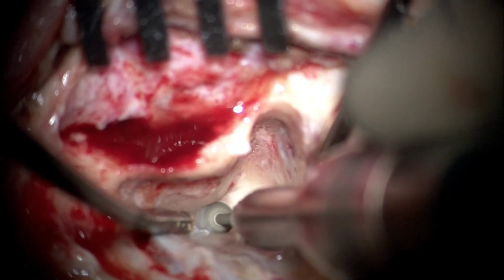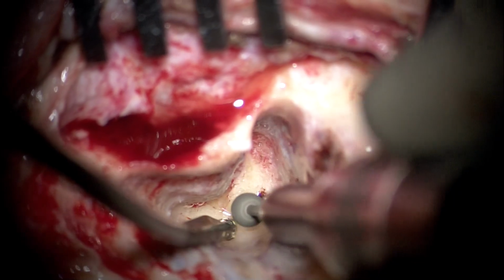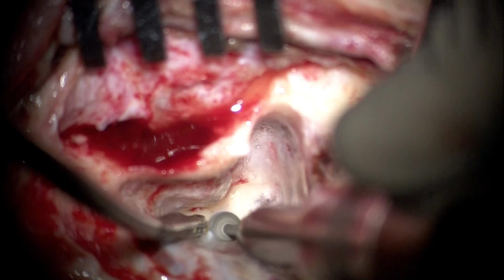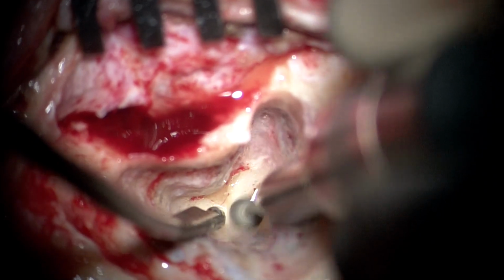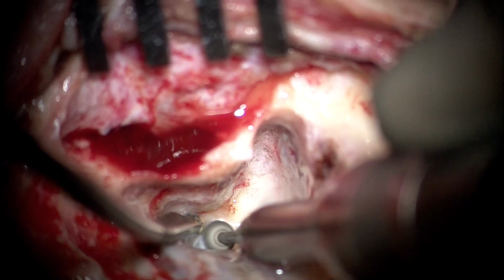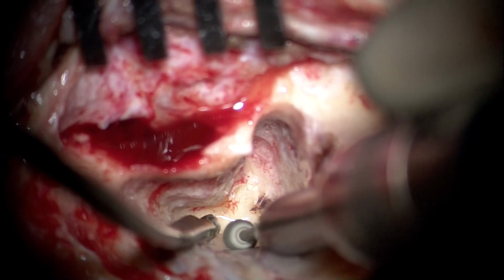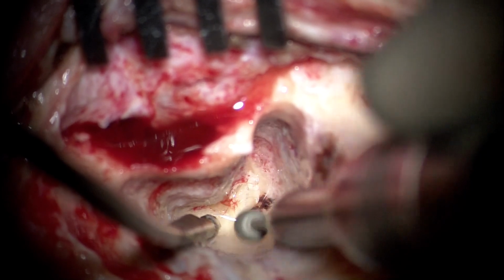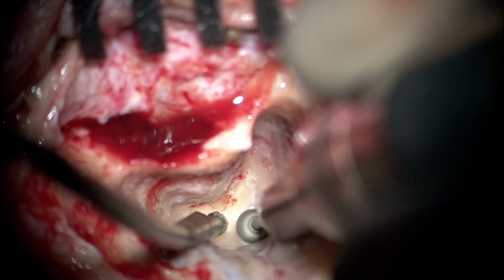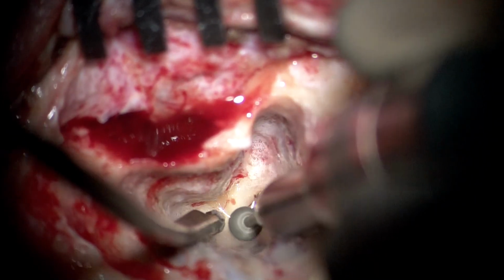So the medial part of the temporal bone, the labyrinthine block of bone, the posterior semicircular canals and the vestibule have now been literally drilled to the limits of our lateral exposure, which are the tegmen superiorly and the sigmoid sinus posteriorly. One can also appreciate the amount of medial drilling that has been done and how our vision has gone quite deep. This is a lot of medial drilling, which normally in a broad otology setup is hardly ever done.